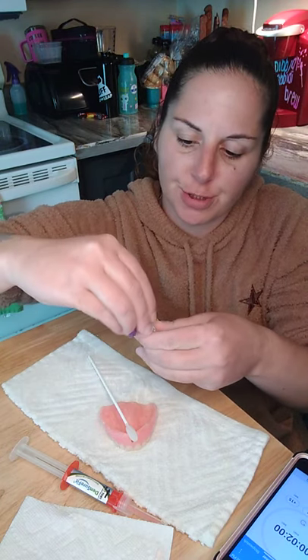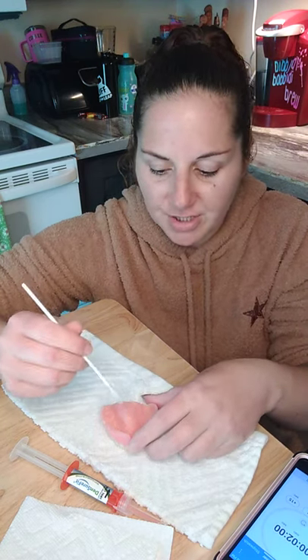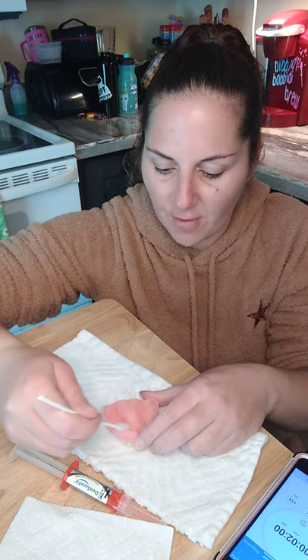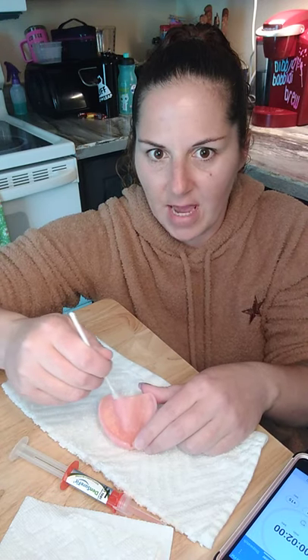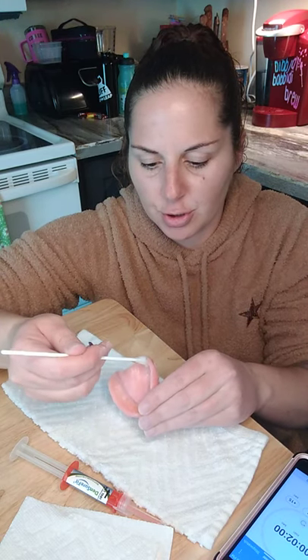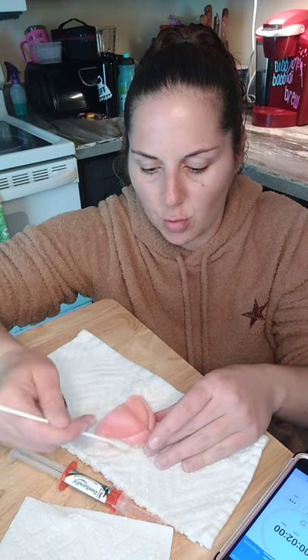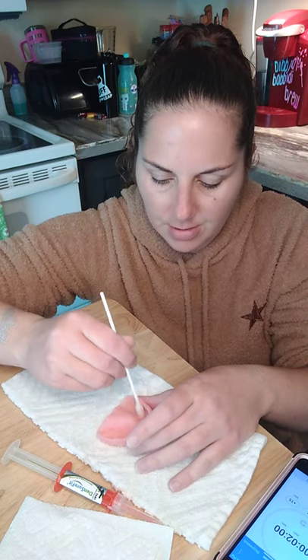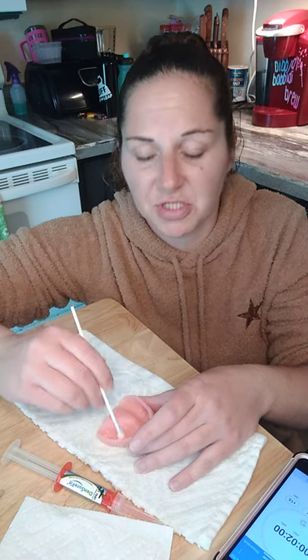Now, once you put the primer on, you have to set your timer for 2 minutes and not touch it. You want to coat it all around your denture. Don't forget to get the edges first. Get every edge. See how I'm getting the back? You want to get the back super well, get the top. Get everywhere because you want it to be able to stick. And then get all over your denture. I'm making sure I'm getting that all good. I'm not missing a beat on this one, guys.